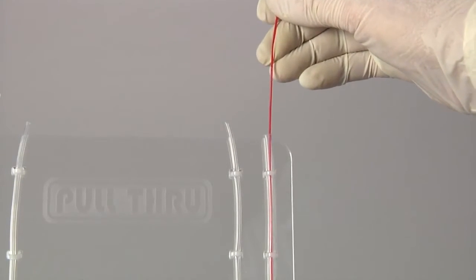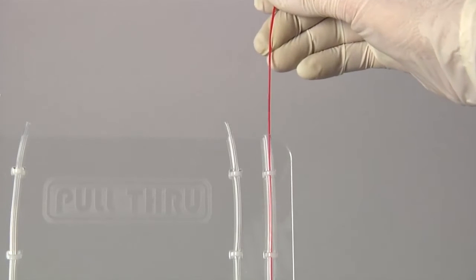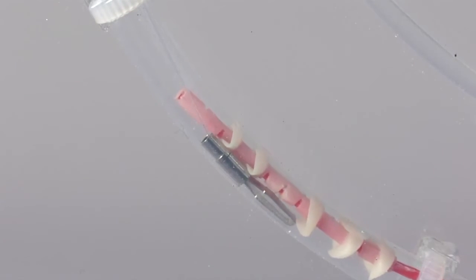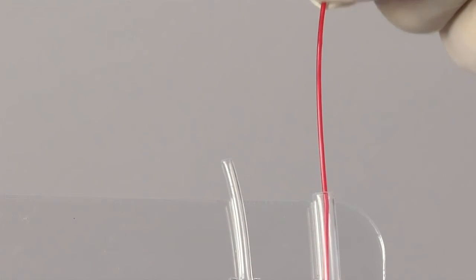If the obstruction becomes lodged hard enough to defeat the pull through, it is immediately obvious to the technician as the resistance from the pull through changes dramatically. The load from each individual wiper engaging the obstruction can be felt as the leader advances.